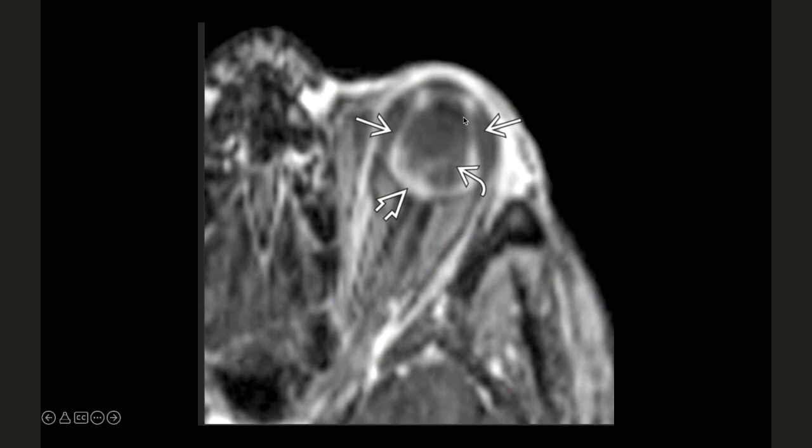And then I see all this enhancement. Probably the choroid is enhancing. Then I see a little bit more enhancement. Sometimes it's hard for me to really tell about the retina, but maybe there's some retinal enhancement too. And then things are going into the vitreous. Now, is it enhancement? Maybe it's inflammation involved. Yes. If someone says, how do I know it's not hemorrhage? Then yeah, I have to look at my other sequences.